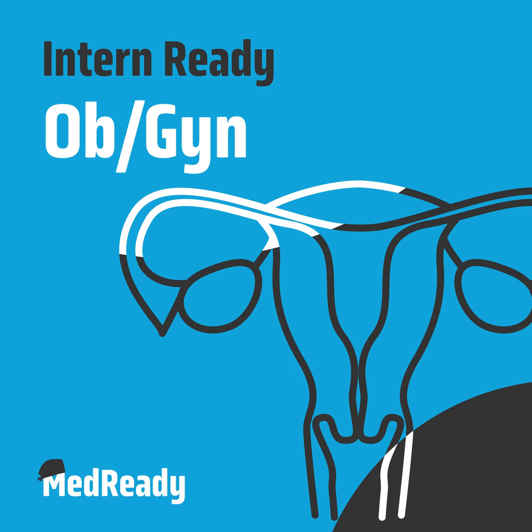It's also compatible with bipolar electrosurgery. So whenever you're using any kind of bipolar energy, normal saline is really what you'll want to use. There are other types of distension media, like hypotonic solutions: 1.5% glycine, 3% sorbitol, 5% mannitol. These are really used when you need to use monopolar surgery because they're non-conductive. They don't have those ions running through them. But they do have a much lower safe amount that you can use.